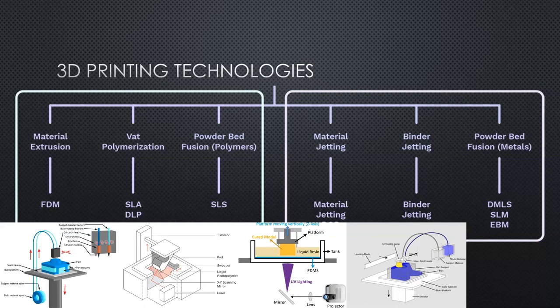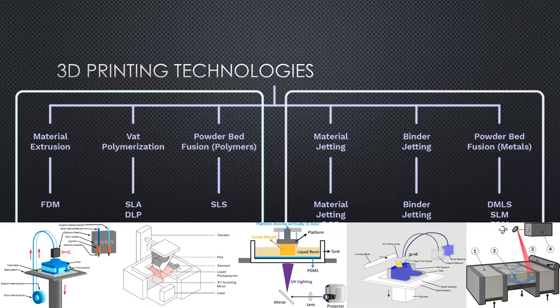And then finally, we have SLM, or powder fusion, also called laser melting. You essentially have a powdered metal and a laser, very much like SLA, and it melts or sinters the powdered metal together to produce metal parts. And typically you'll find these machines in large outsourcing facilities. An excellent way to still offer metal restorations if you're anything like me and absolutely terrified of casting PFMs using an acetylene torch and a broken arm casting machine.